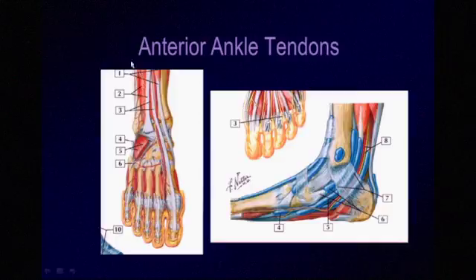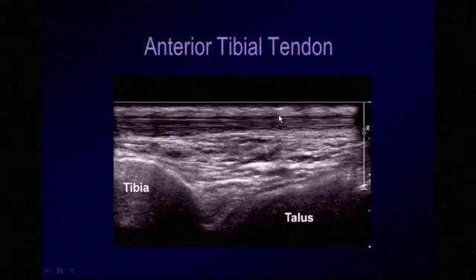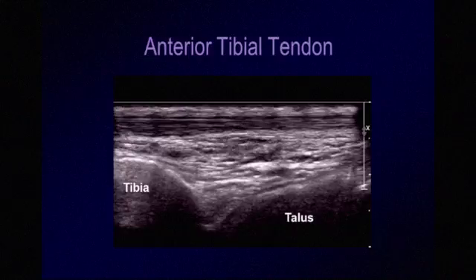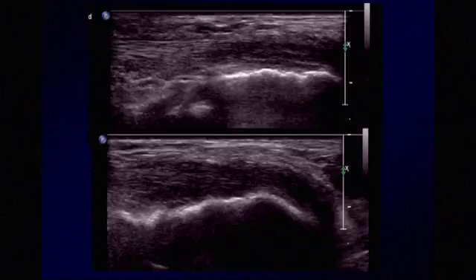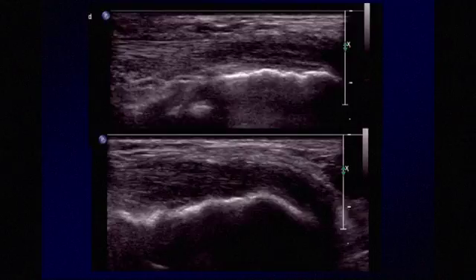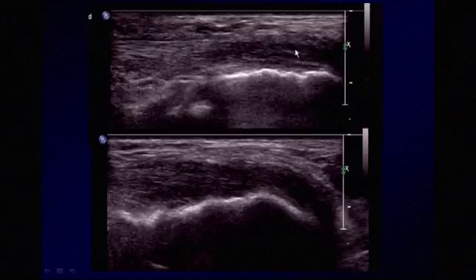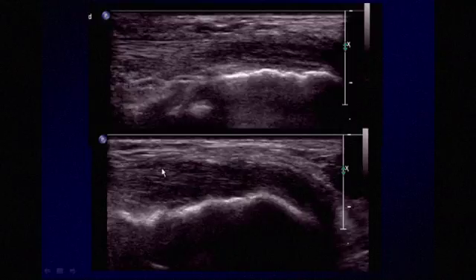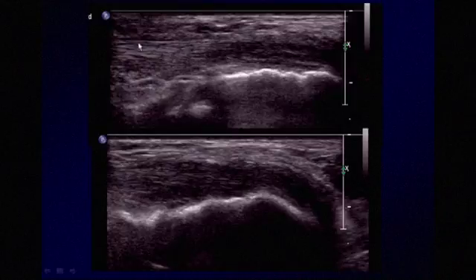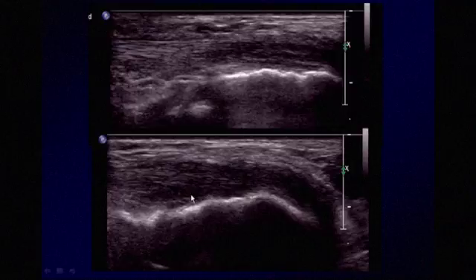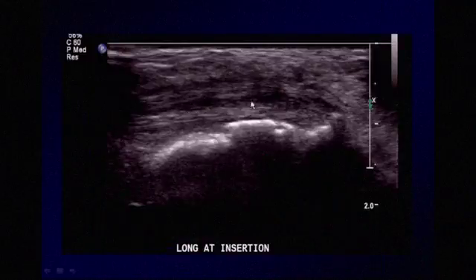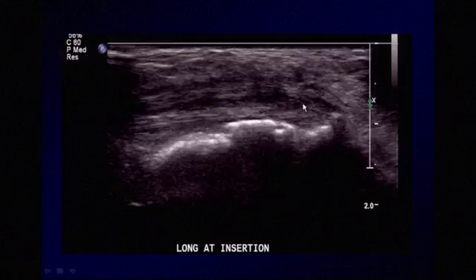Moving on to the anterior ankle tendons: the tibialis anterior tendon, the extensor hallucis longus tendon, and the extensor digitorum longus tendon. The anterior tibialis tendon is composed of fine fibrillar echogenic lines and is hyperechoic. This patient presented with a painful lump on the medial foot to rule out ganglion cyst; instead, we see a hypoechoic structure with fine hyperechoic lines within it. Tracing it proximally, it connects to the tibialis anterior tendon — this is tendinosis of the tibialis anterior. Looking closely at the insertion, there is also likely a longitudinal split tear within the tendon.